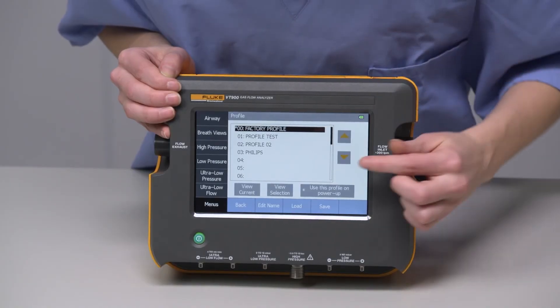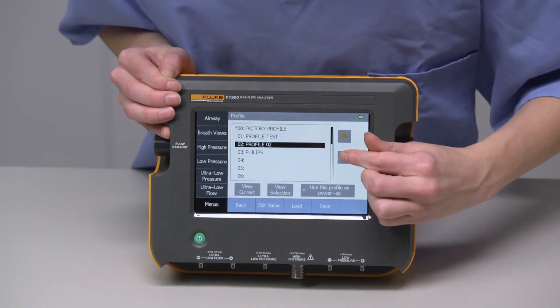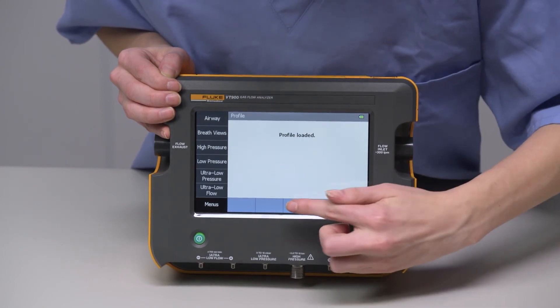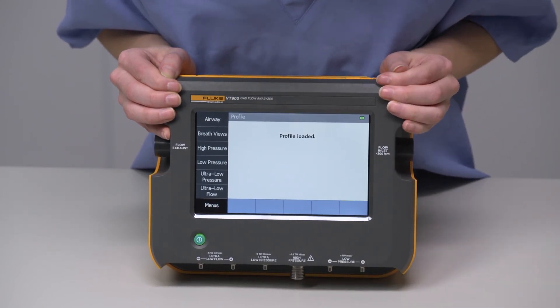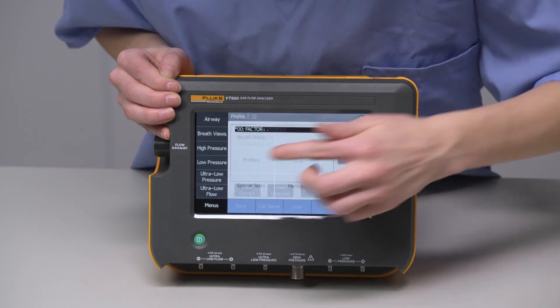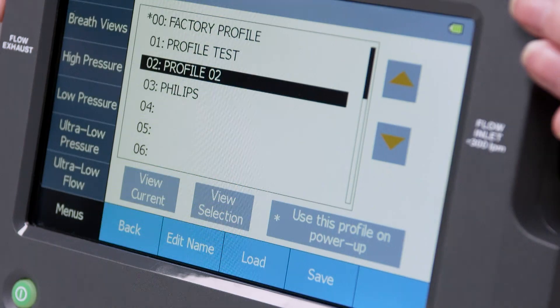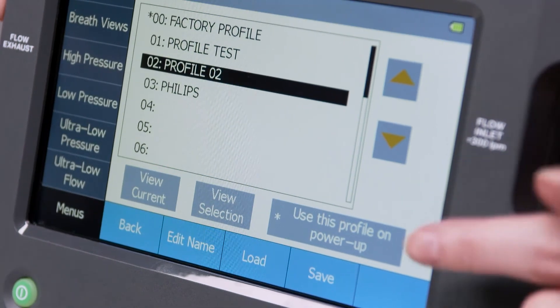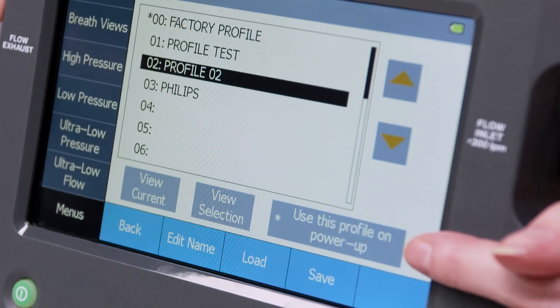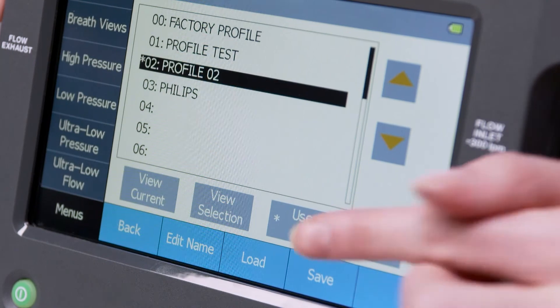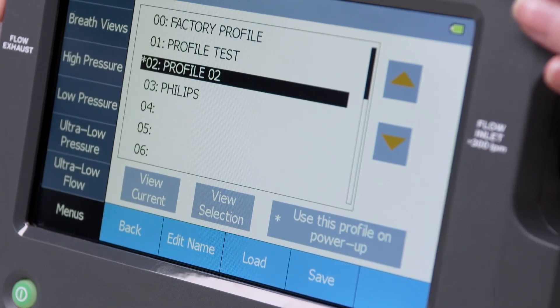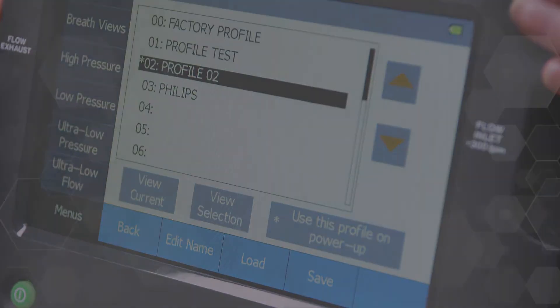To use a different profile than the one you're on, highlight it, then press Load. If you prefer to always test with a certain profile, you can set it so that when you power on the device, it will be automatically set to your profile preference and you don't have to set up the test device.